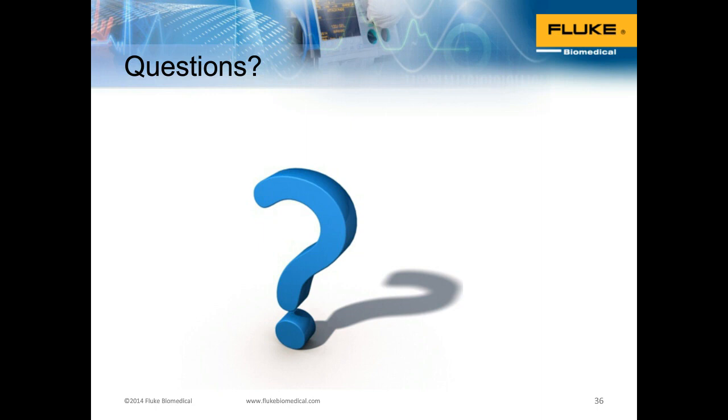Great. And what are your suggestions for testing the smart pumps, which are integrated with the clinical information systems, especially checking their bidirectional communication? So at this point in time, we don't have a recommendation for smart pumps in terms of bidirectional communication. The only pumps that we say you can test are the ones that require the volume and occlusion measurement. So whichever pump that you have, whether it's smart pump or not, at this point in time, bidirectional communication is not available, at least not through our solutions.